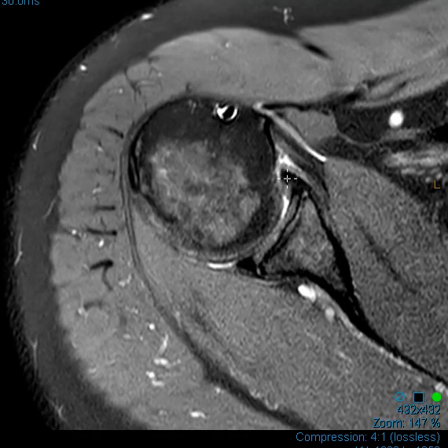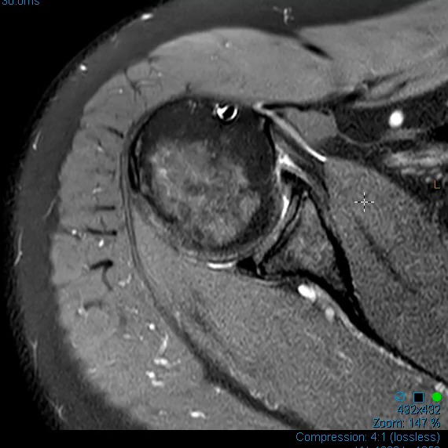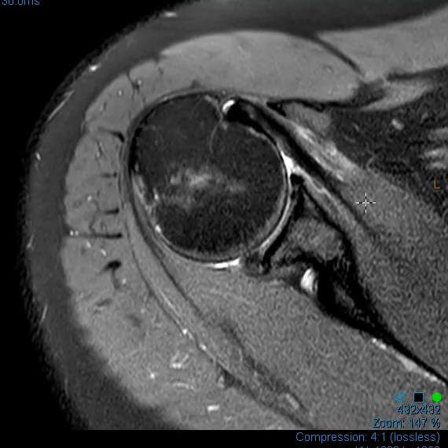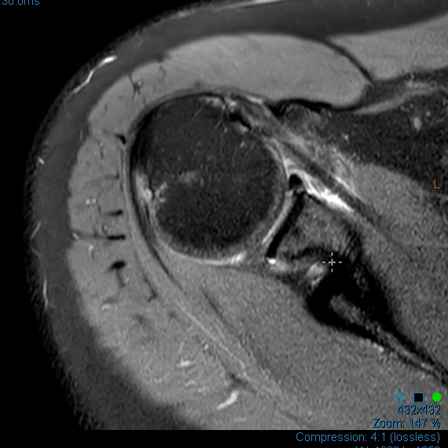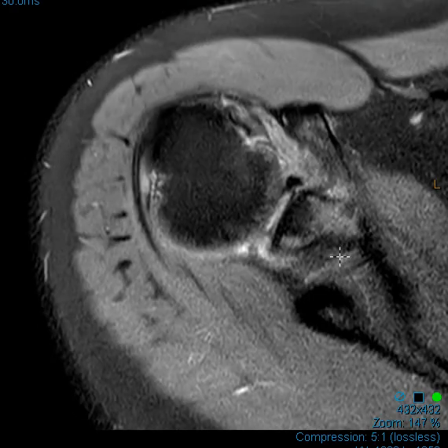The anterior labrum is here. As we go down to the bottom, things look okay. As we roll up towards the top, in the back here, the labrum does not look quite so good. In front, it's dark — a nice triangle — but back here, it looks foggy and gray.